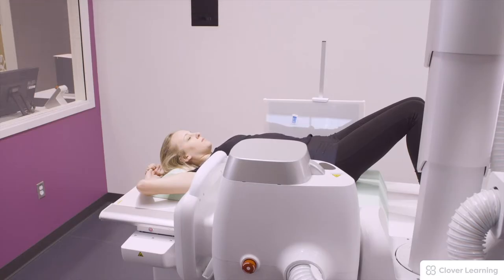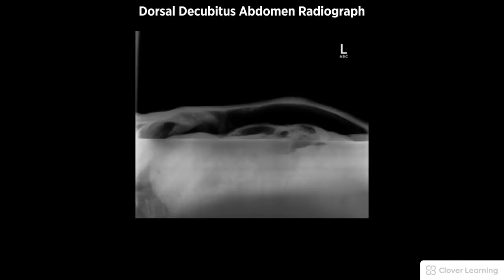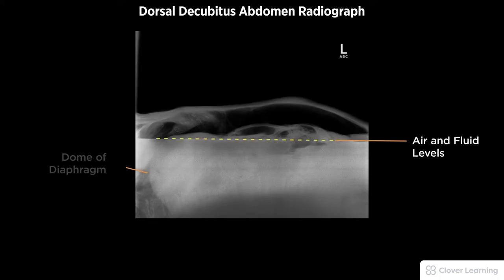The exposure is made. A diagnostic dorsal decubitus abdomen radiograph should be free of motion and rotation, and include the domes of the diaphragm, the superimposed ilia, and pedicles of the lumbar spine.